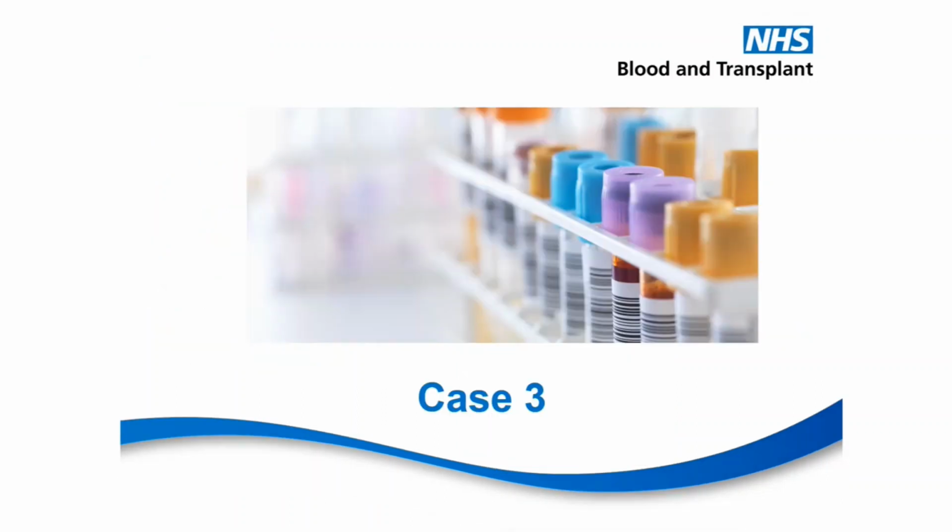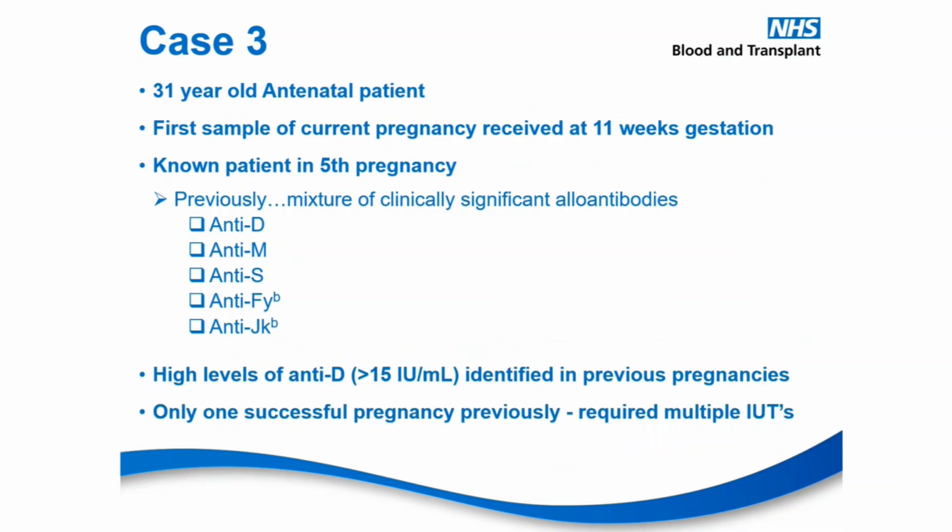So moving on to case 3. We have a 31-year-old antenatal patient. The first sample of the current pregnancy was received at 11 weeks gestation. This patient was known to us and she was in her 5th pregnancy.